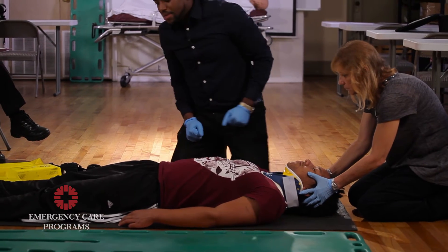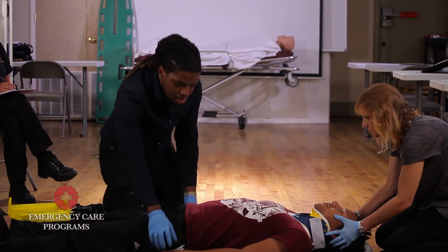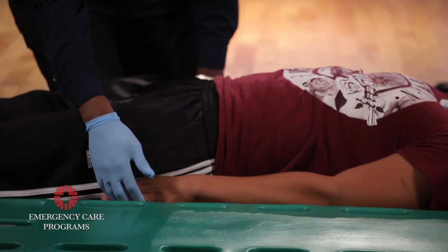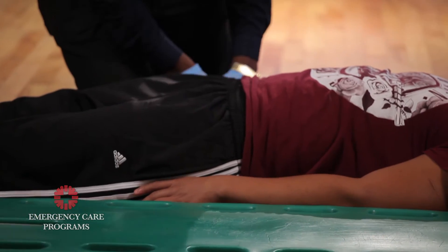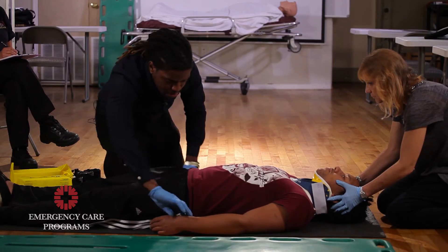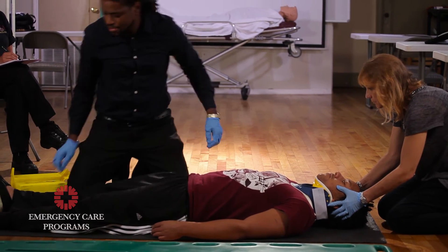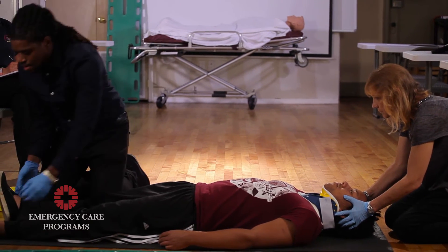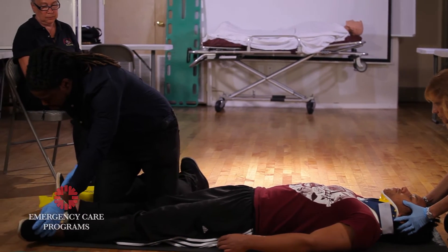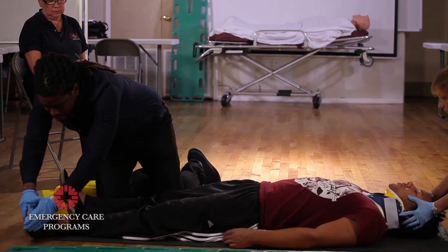At this moment, I'm going to check for pulse, motor, and sensory in all the extremities. Look at your fingers for me, please. What finger am I touching? What finger am I touching? Pulse is present. Pulse is present. Look at your toes for me, please. What toe am I touching? What toe am I touching?